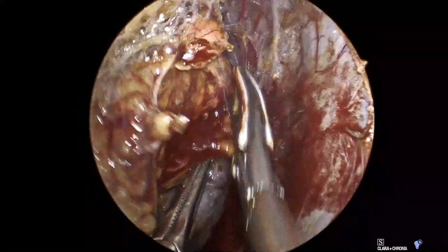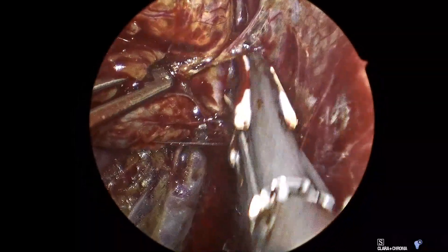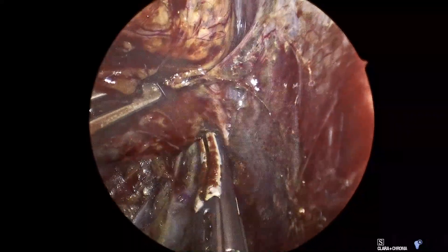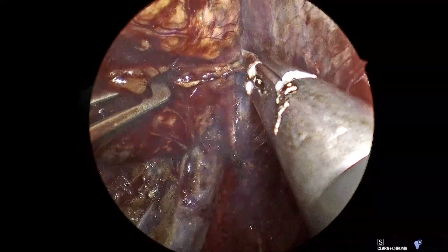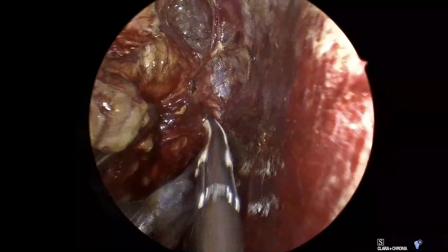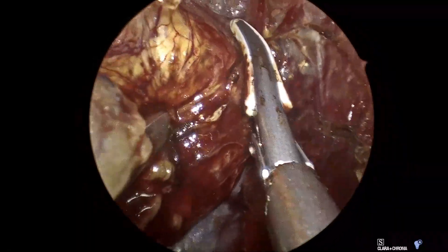As you can see, I'm using the grasper to push the adrenal gland but not grabbing adrenal tissue, because it's friable and for pheochromocytomas, if you spill tumor cells they can re-implant and cause pheochromocytomatosis. So the tumor is handled very carefully — first of all not to spill tumor cells, but also not to release unnecessary amounts of metanephrines that will create hypertension during the operation.